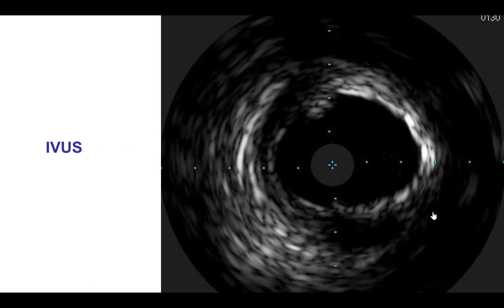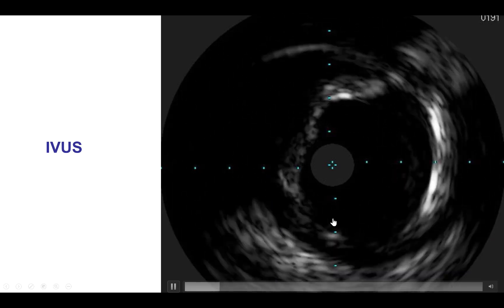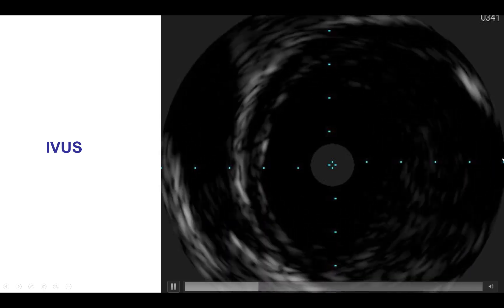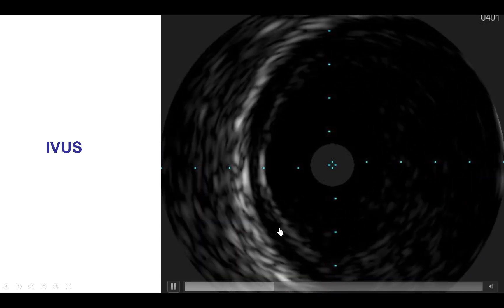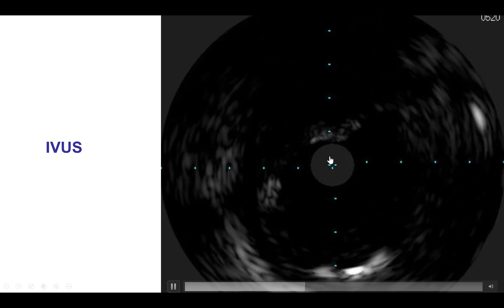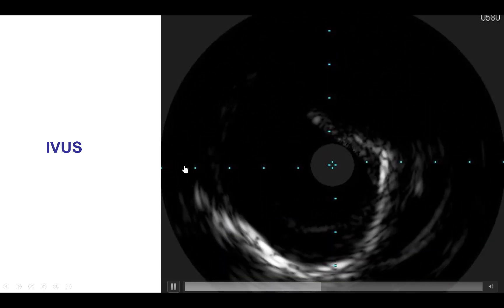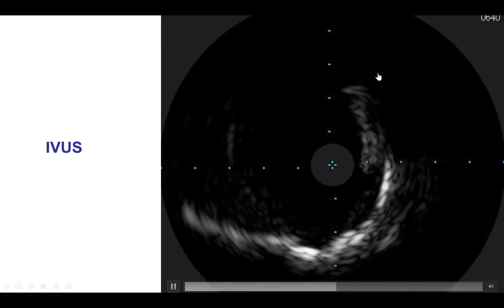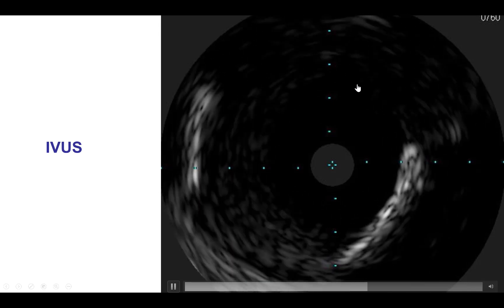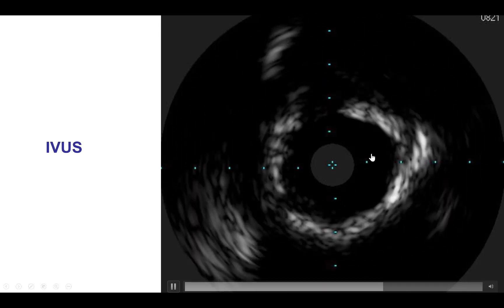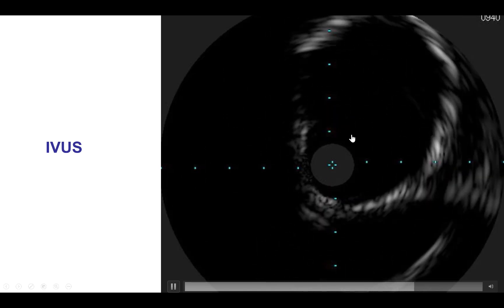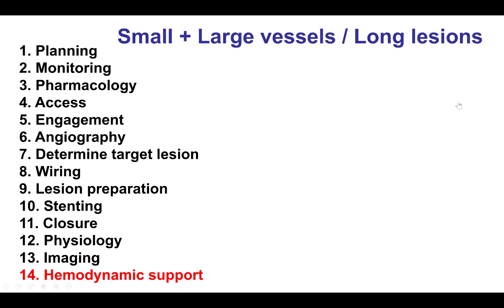This is an example of IVUS in the case shown before with the aneurysm. We can see that the vessel becomes really large. When performing IVUS in very large vessels, the diameter of imaging should be increased to allow full visualization of all the walls of the vessel. It is extremely important to perform intravascular imaging to choose the size of the stent, which is based on the reference segment and not on the aneurysmal part of the vessel.